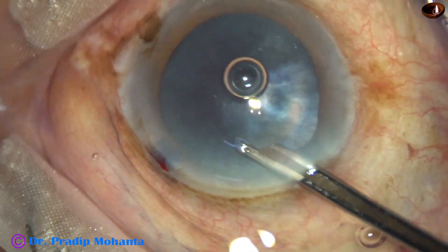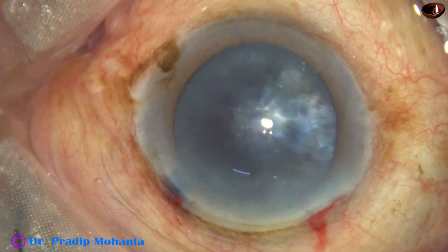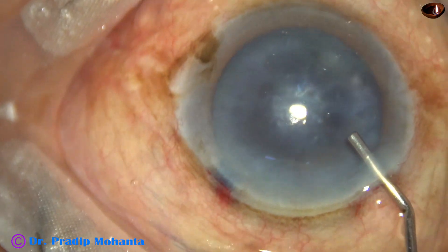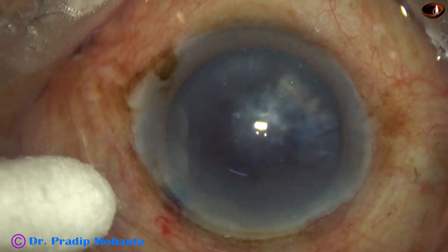We get uniform anterior chamber all around if we wash out the dye. And now, 2% hydroxypropyl methylcellulose is injected into the anterior chamber. And now it's time to do capsulorhexis.